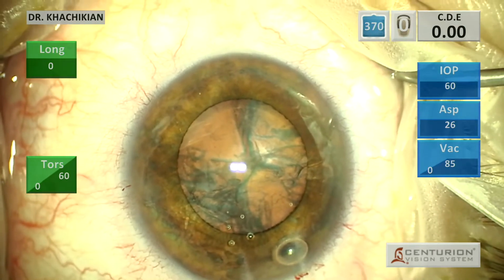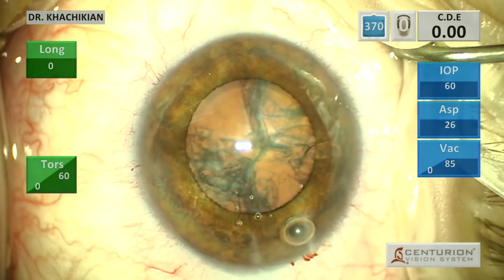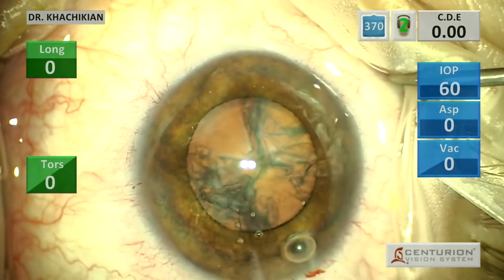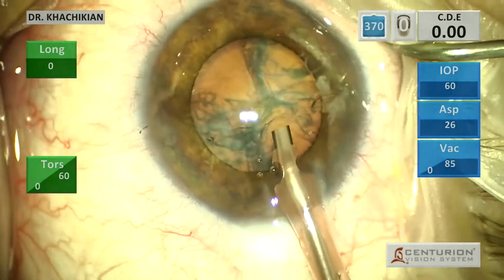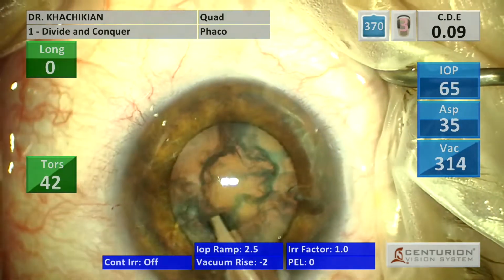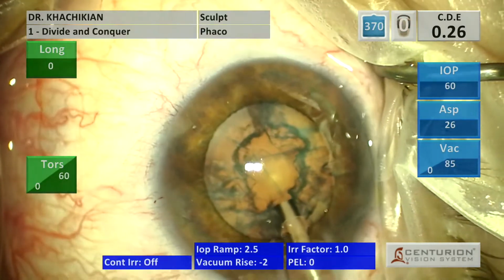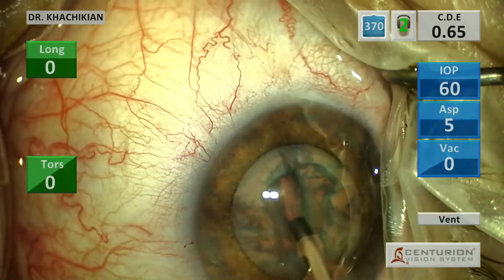We reinflate with some viscoelastic to make sure that the endothelium is covered, and then I'll check the flow through the phaco handpiece and make sure there's good and balanced flow of the BSS. And then I go into the eye, and I usually will start on quadrant mode to clear the tip of the phaco handpiece. Once it's clear and I remove some anterior cortex, I begin to sculpt.